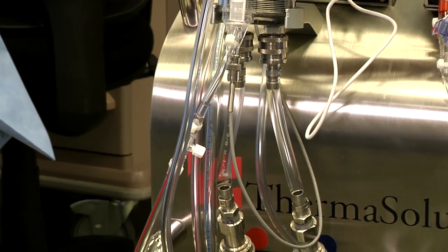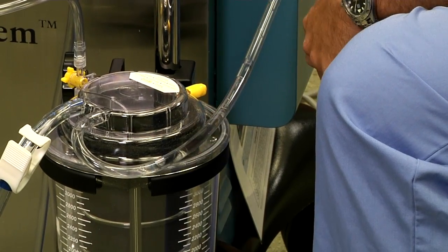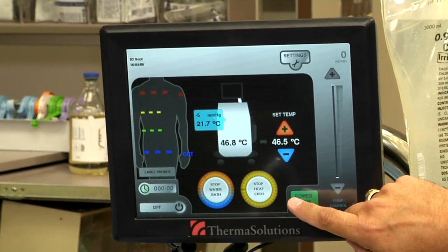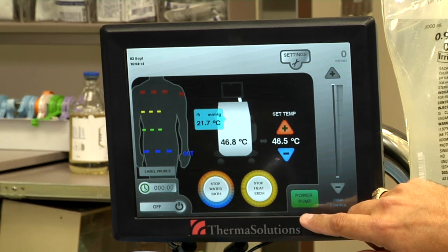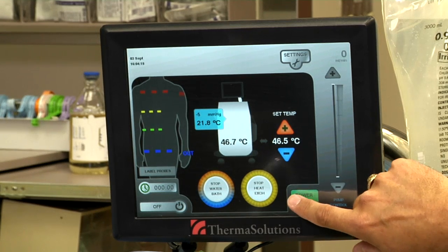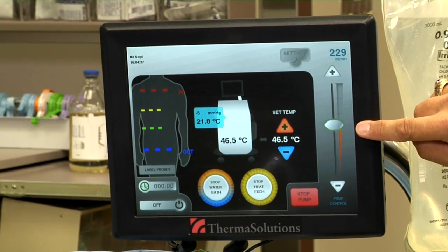Now with the patient fluid filling in the reservoir, we can go up to our screen, power on our pump, and actually begin to circulate the fluid throughout the tubing set. This is pre-warming the fluid so that when we hand it to the sterile field, the fluid is close to the temperature that the surgeon will want. The pump is powered up by pressing pump power, which energizes our slider, and we'll move it approximately halfway up.